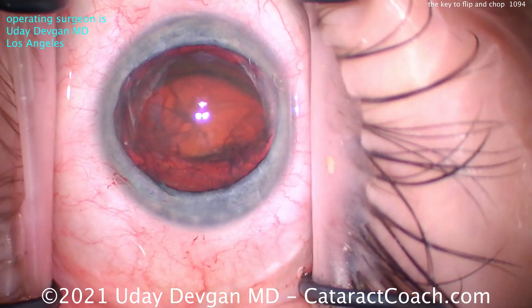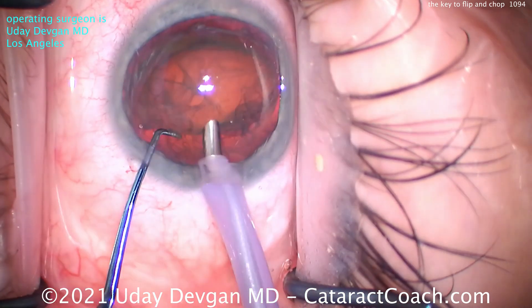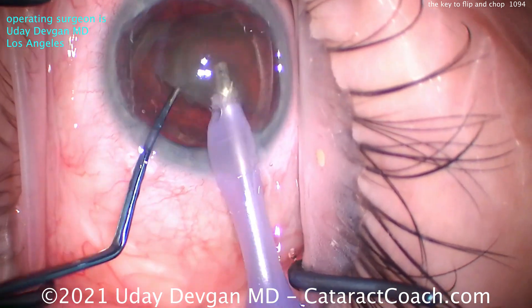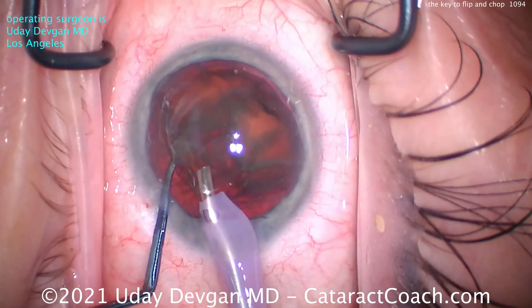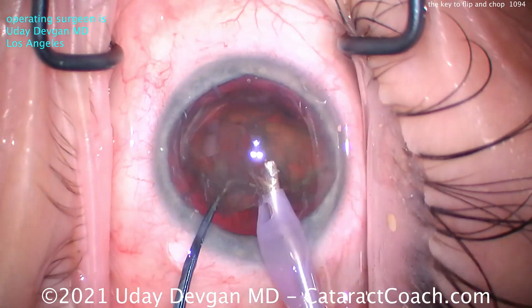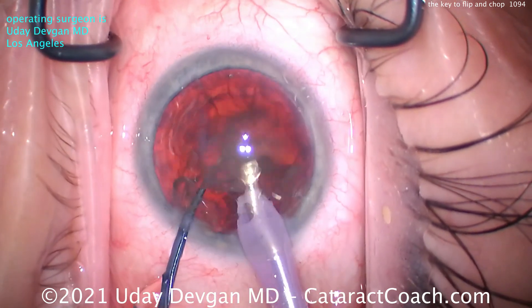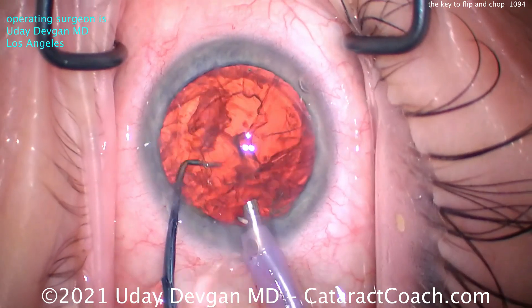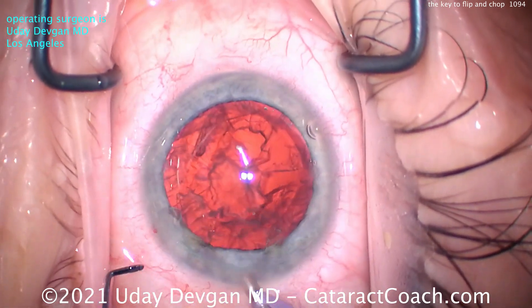A little more dispersive viscoelastic to protect that central cornea. FACO probe going on chop mode — high flow, high vacuum. Buzz in, chopper goes around the nucleus, and we already have two halves. You don't need more than two halves here because this lens has maybe 2-plus nuclear sclerosis — not that dense. We can just wolf it down. In much less than one minute, the entire nucleus is gone.